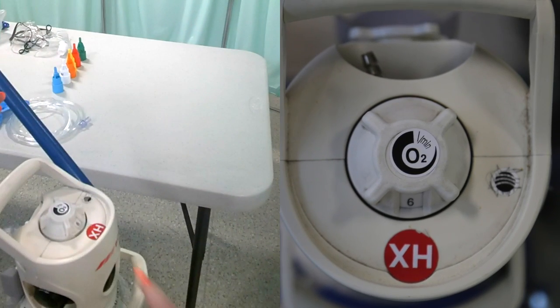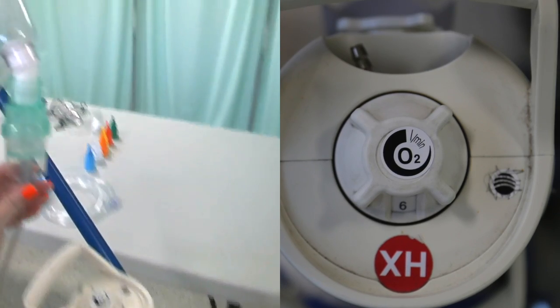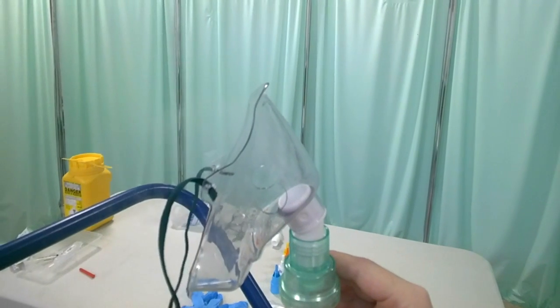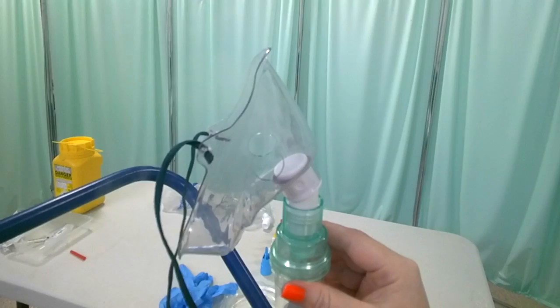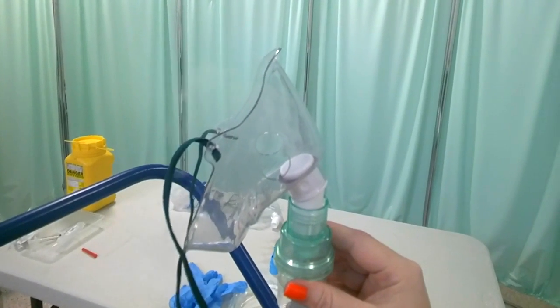You can see that there in the cylinder. And what you'll notice is that you're getting a good aerosolizing of the medication there. In this case, the saline. But it could be adrenaline, it could be salbutamol, could be a whole range of other medications.